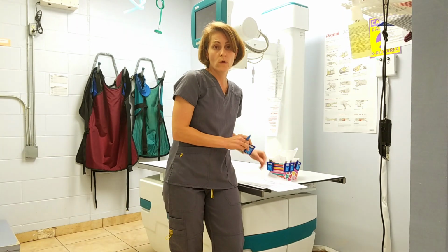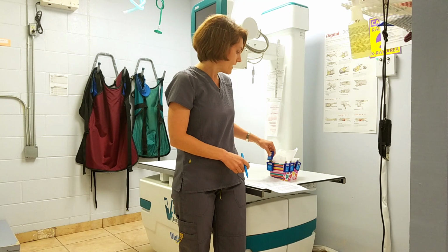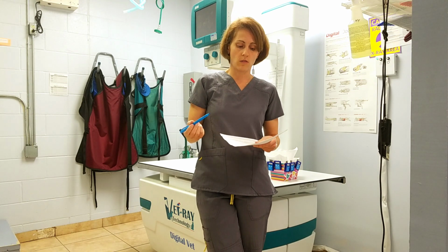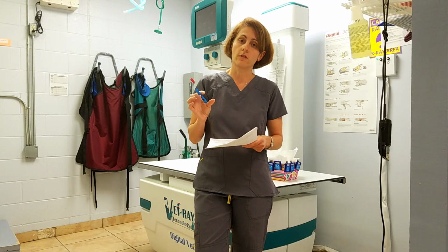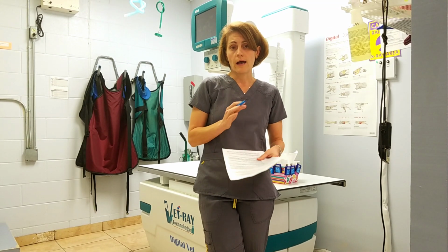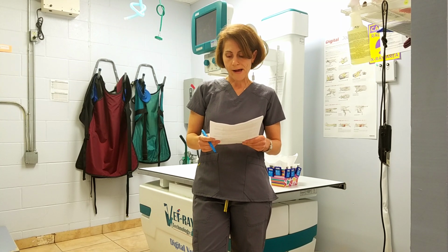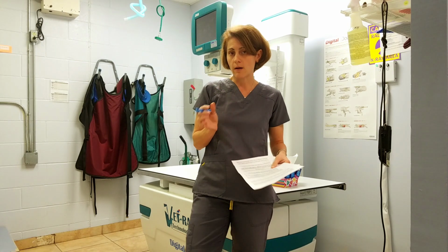At our practice, we do not feel like there's really ever any reason for a pregnant woman to be doing x-rays, so you will never be asked to do that. But if any type of situation should arise, you should note that within the state regulations, there should be an individual badge for the baby as well, and that's actually worn under the apron. But again, if you are pregnant, please let management know you will not be asked to do x-rays. We don't feel like you should be doing that. The badges are each assigned to an individual person, so you should never switch out badges. Even if you are filling in or working for somebody that day, you should be wearing your own badge, not someone else's badge.